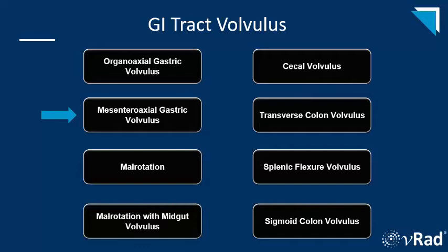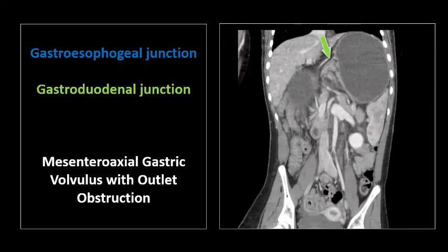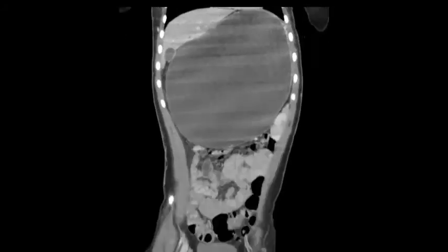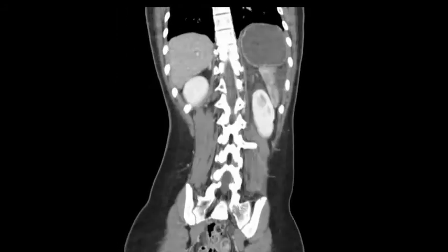The next case is also gastric volvulus, this time along the stomach's short axis, called a mesenteraxial volvulus. Here we see the gastroesophageal junction and the gastroduodenal junction, which are very close together, and you see swirling at the root of the mesentery. This is a pediatric patient and the stomach is significantly distended with fluid, and there's no hiatal hernia. The coronal cineviews show the extent of gastric dilatation and the relevant anatomy. The stomach is obstructed, but there's no evidence of ischemia.